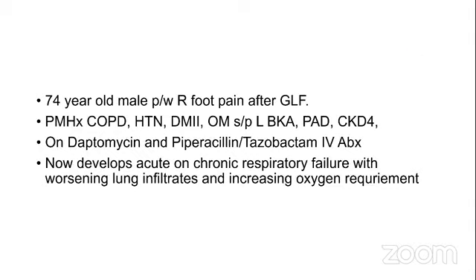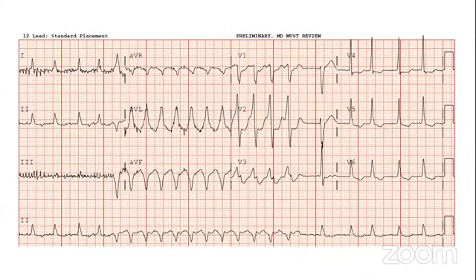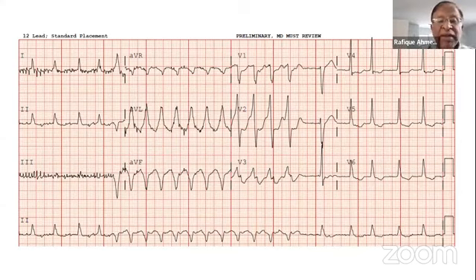So this is another patient. Sir, I have a question. In the previous ECG, Rafiq, sir, it has been a teaching that when you see a very wide complex tachycardia, a really wide regular tachycardia, you must exclude metabolic causes. Though it is obvious that it could be VT, the duration of the QRS is almost 200 milliseconds. And it is said that if it is more than 180 milliseconds, don't go more on the side of ventricular tachycardia. So what do you think? Do we need to go more on the side of a metabolic cause?